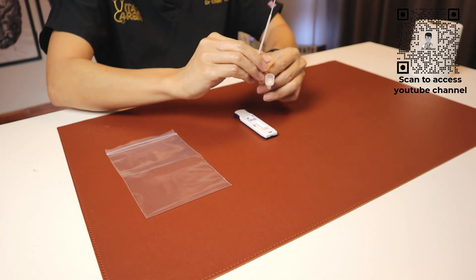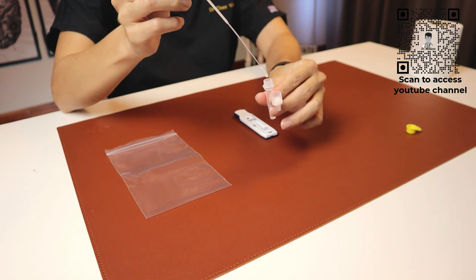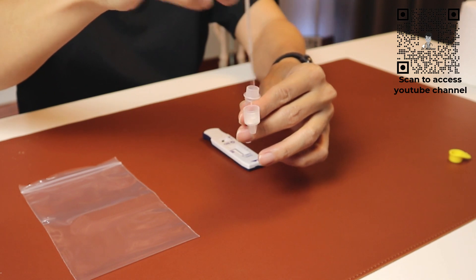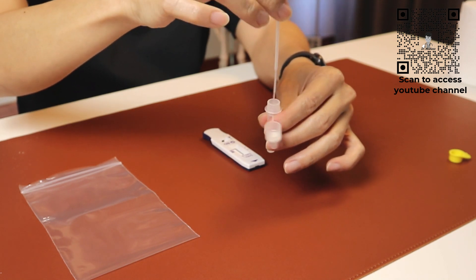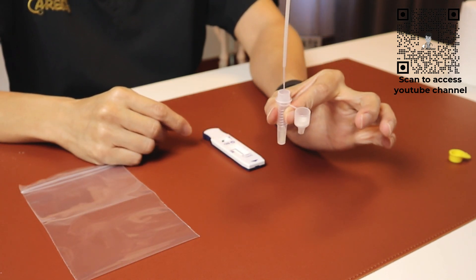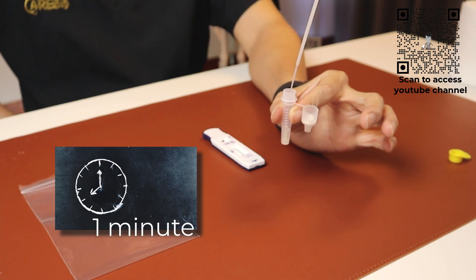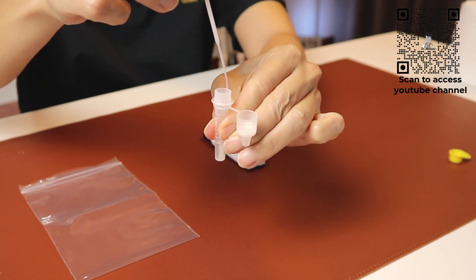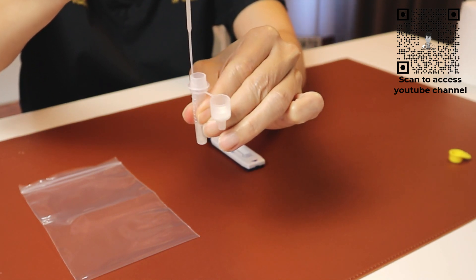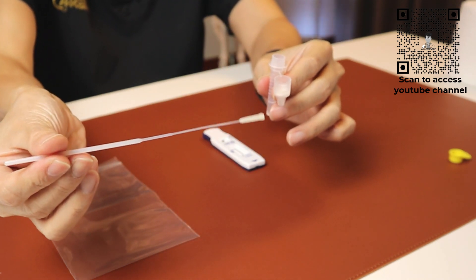Once done, what we need to do is to dip the swab stick. Open up the reagent bottle, dip the swab stick into the reagent, then swirl it around to ensure a good mixture, and leave it standing for about a minute or so. Following which, squeeze the side of the reagent and pull up the swab stick, and dispose of the swab stick into a dustbin.